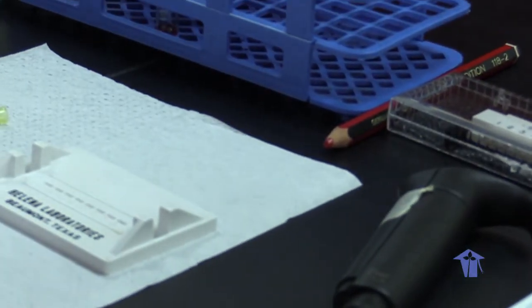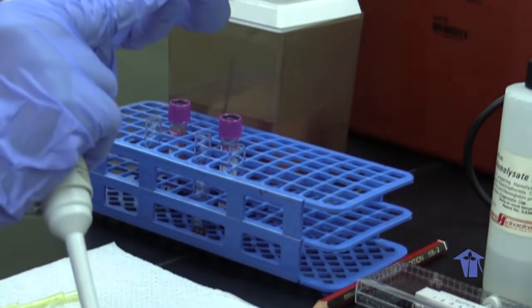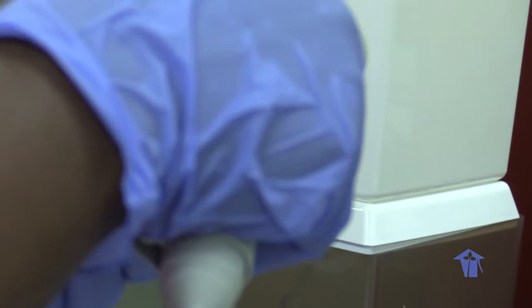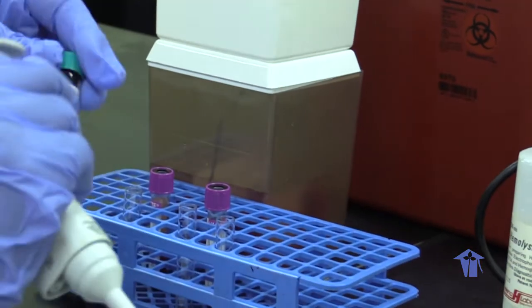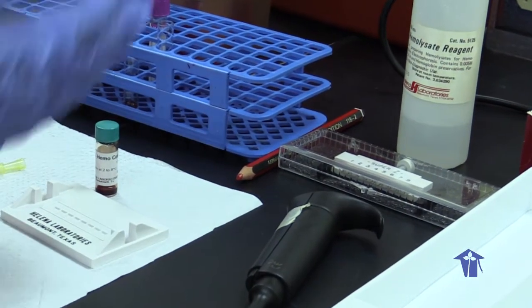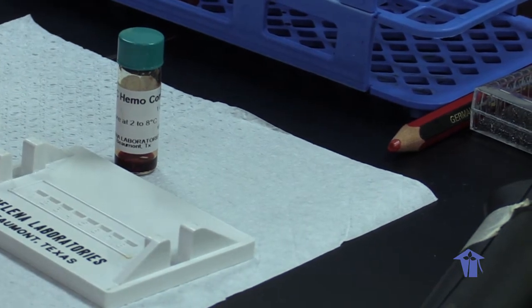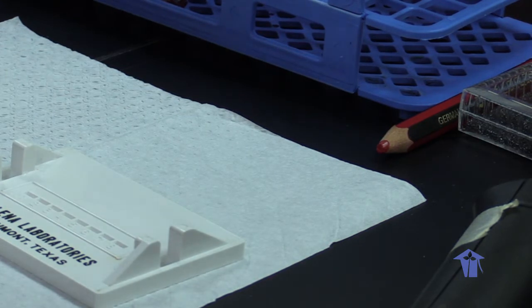So this here is a hemoglobin electrophoresis control sample. We have the A band, F band, S band, and the C band. In all laboratory testing, we need controls. In this case, we always put our control in well 1, position 1. So therefore, when we are reading our plates, we can read them against our controls, and we'll have reference lines, reference marks where the different hemoglobins will migrate to on the cellulose acetate plate.